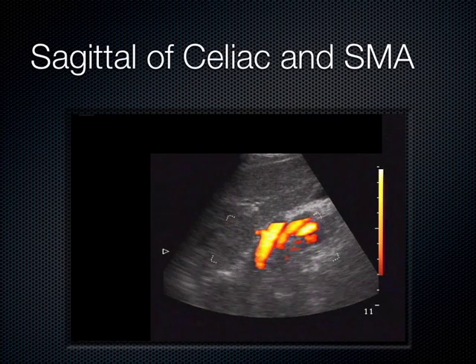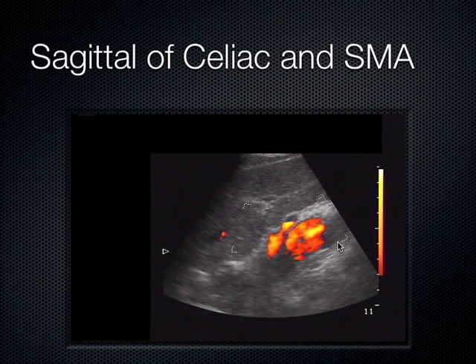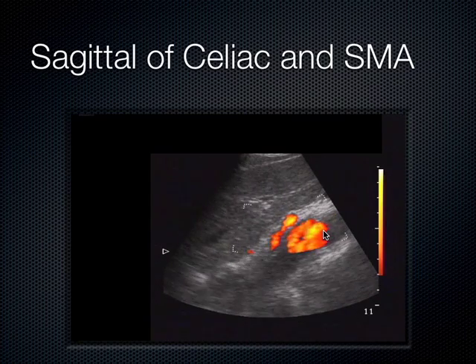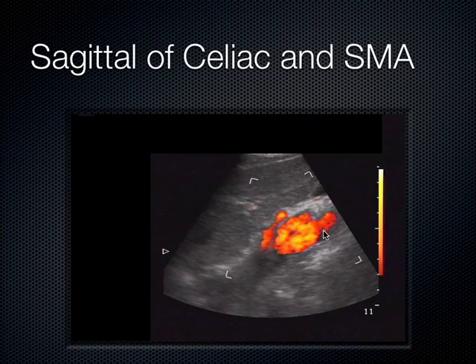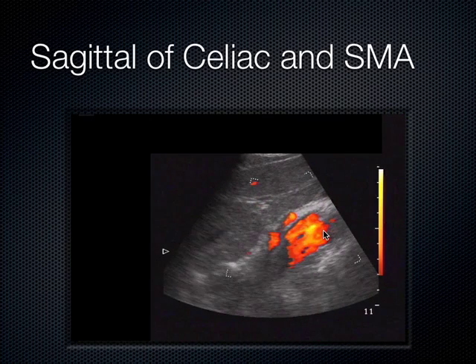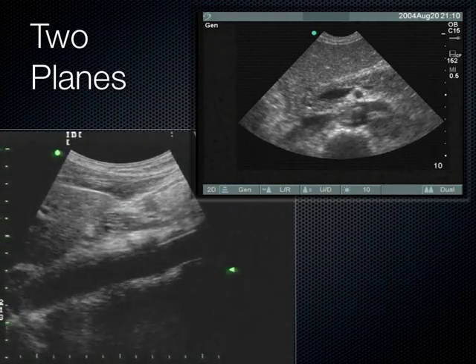And on ultrasound, this is an example here of a sagittal view with the aorta running along here. And we can make out with the color, this is that first branch, celiac, second branch, SMA, and this is just some flow left in the aorta where this happens to be picking it up. So just to show you that while you don't need color flow really for much here, with the aorta, it helps to outline and give the aorta a little bit of definition for you.